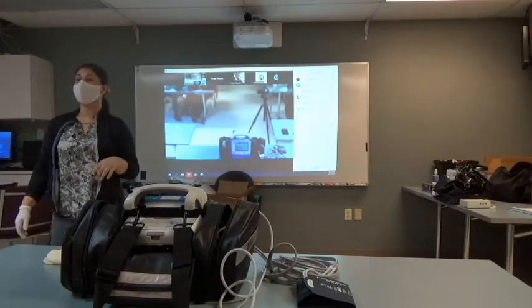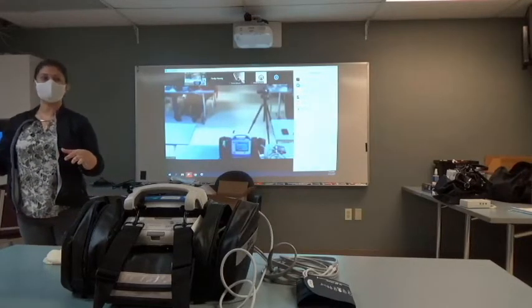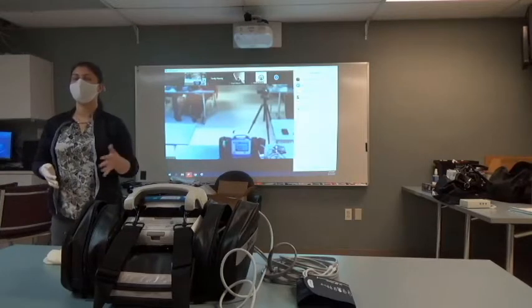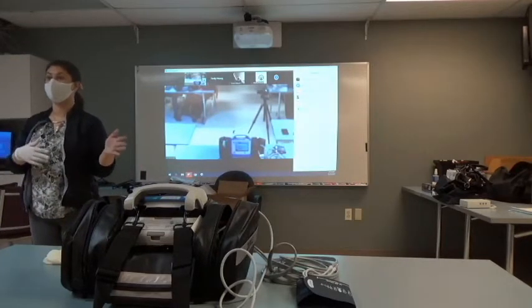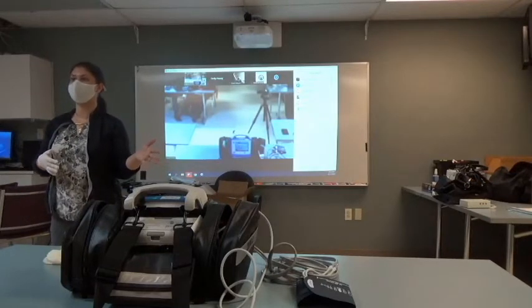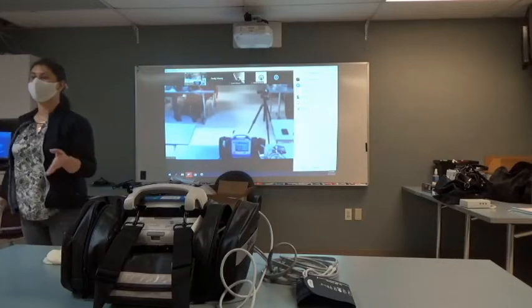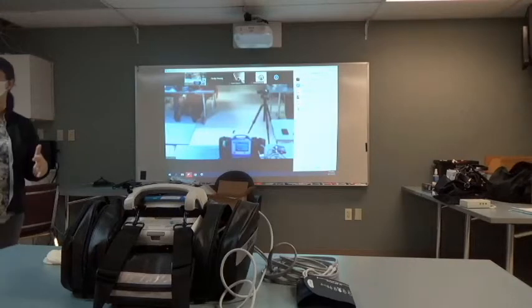Yeah, so here's one thing I'll caution with that, with this particular device. If you guys, say, for instance, turn it on, and you set the blood pressures to every 5 minutes, and you turn it on, but you never take the cuff out, and it's still sitting in the bag, guess what's going to happen in 5 minutes? It's going to create a big mess. So just keep that in mind. I don't know what works best for you guys, but I just want you guys to be aware of that.